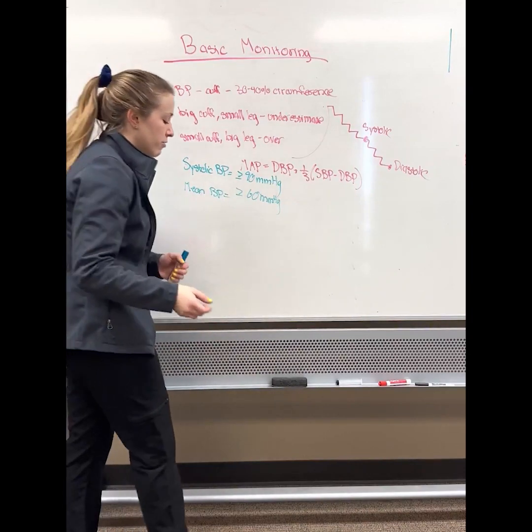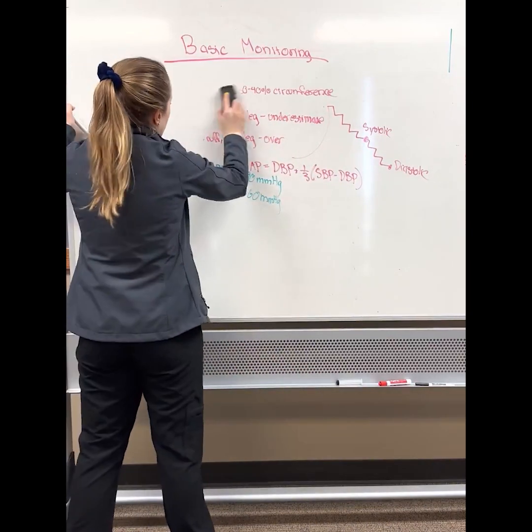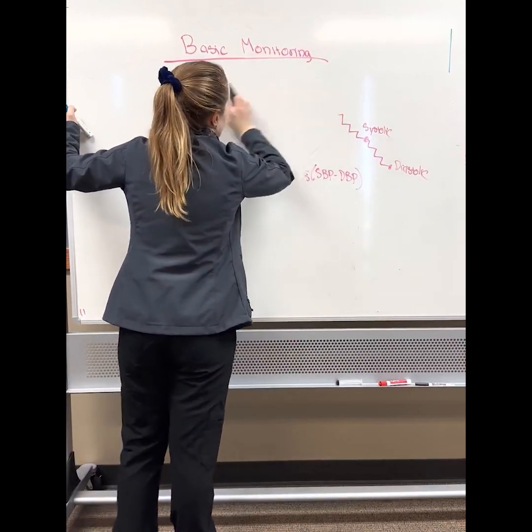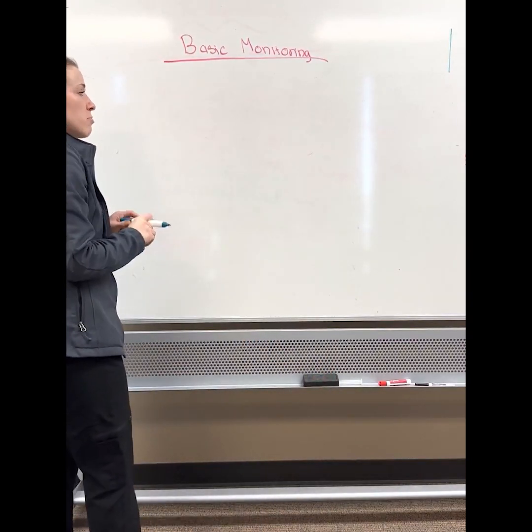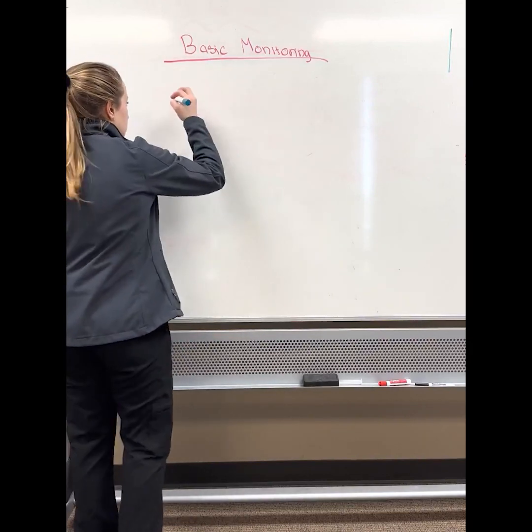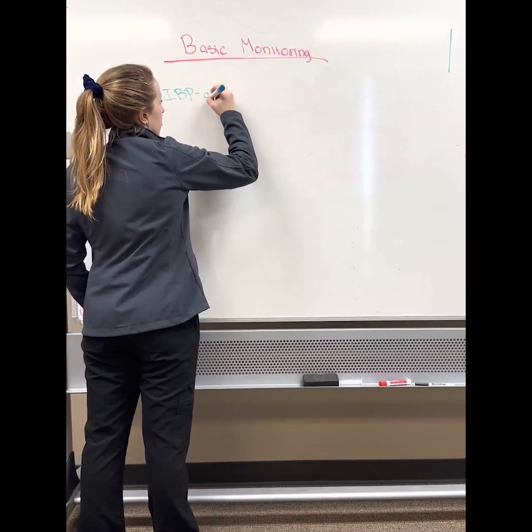It's going to run probably every 3 to 5 minutes, so it gives you gradual trends over time about how the blood pressure is, like is there bleeding, is the animal reacting at all? Now, if you have a patient that's really debilitated and you want moment-to-moment accurate information, you can put a cannula in an artery and get invasive blood pressure monitoring, IBP, or arterial blood pressure.